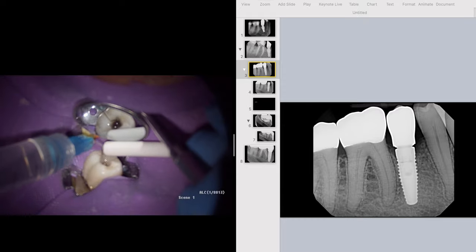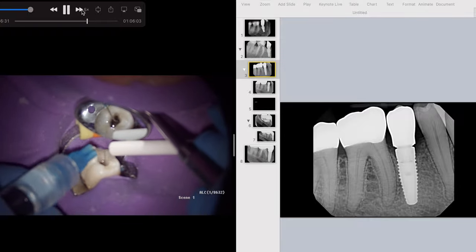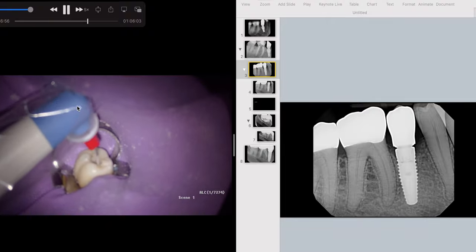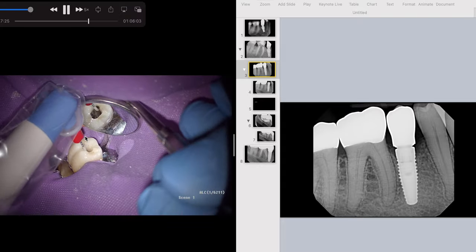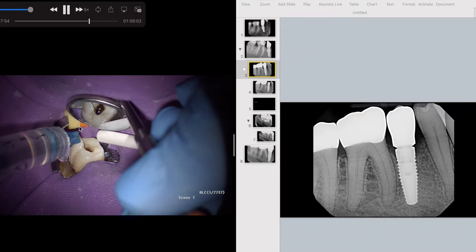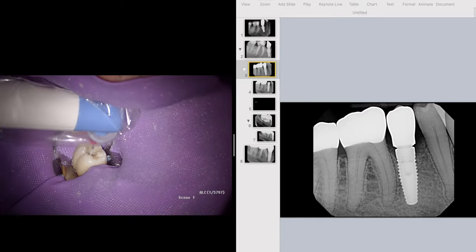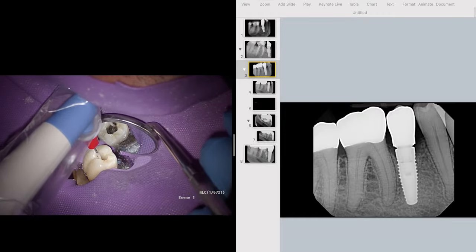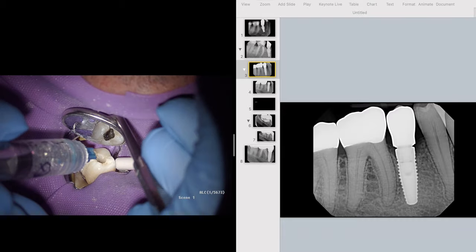That's cleaning and shaping done. Now we go through our irrigation protocol. I'm going to use the Endo Activator — it's nylon tip, just placed in there, activating the irrigant. We're going to use some Q-Mix — I don't routinely use it, but this practice has it. Normally I just use EDTA and full strength hypochlorite. We'll run the activator again, then do the Q-Mix rinse, then try our gutta-percha points.